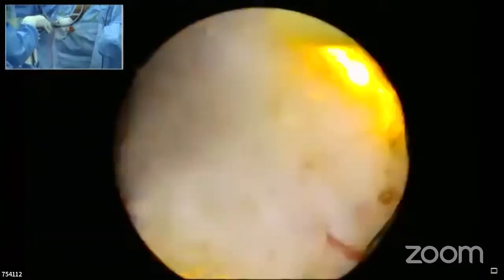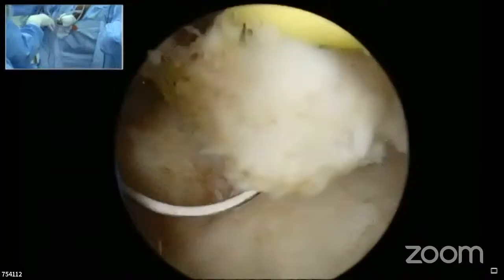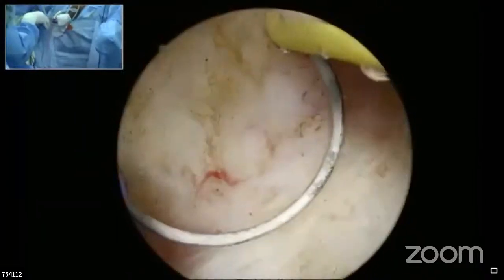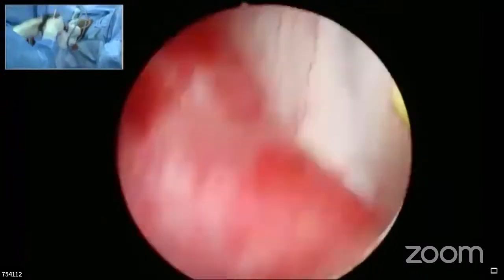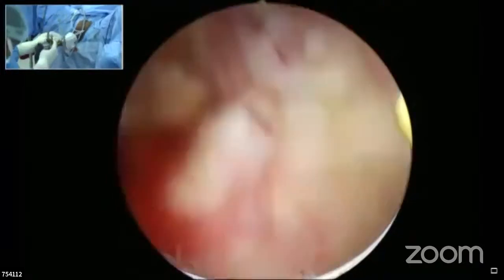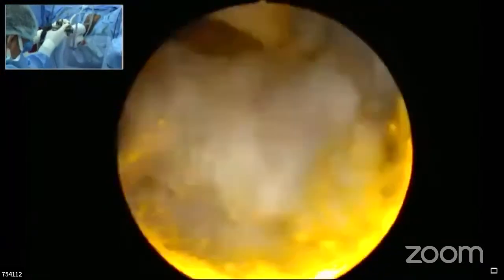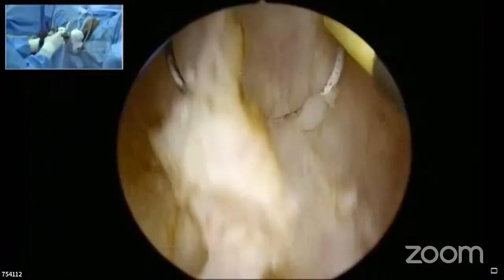No, we should not forget that every surgery has got complications. True, sir. Until a patient has earned his surgery, we should not do it. If you force it on him and something goes wrong, then he's not going to leave you. If you're coming near to the apex, I think everybody was asking about how to manage the gland at the apex. I think you need to be a little slower and show that part.